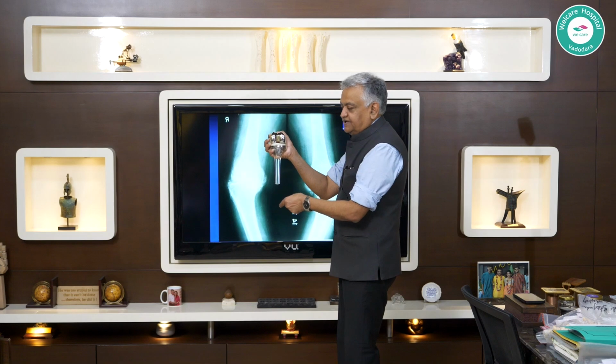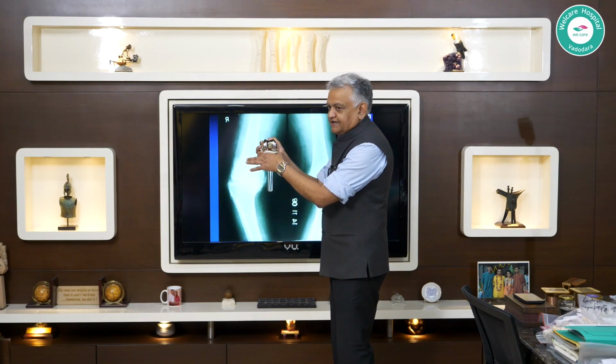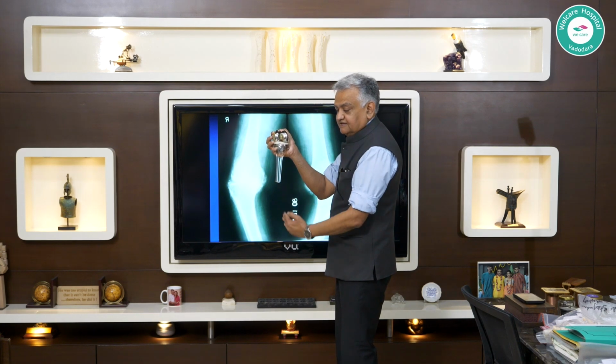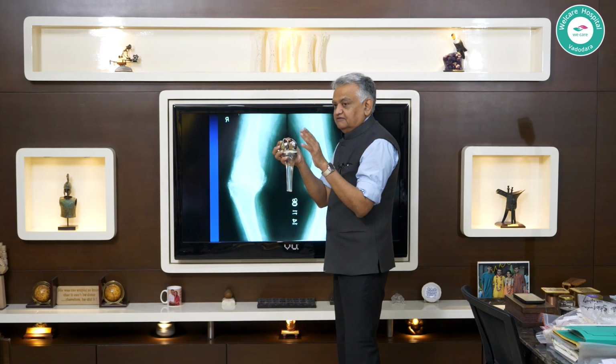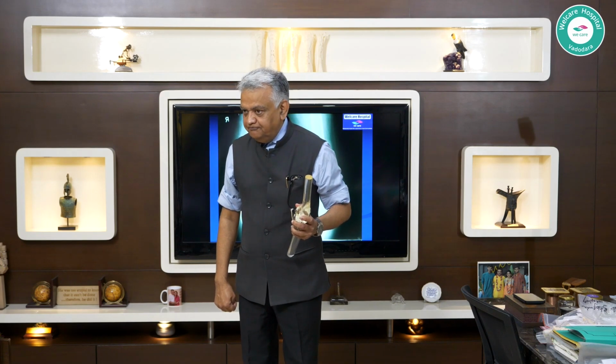So you can ignore this, or in fact you should ignore this, and as long as you get like so from midpoint here and the midpoint down there, if that is in a straight vertical line, then the cut that you are going to make will bring the overall alignment of your limb into that conceptual mechanical axis, which is supposed to be at 180 degrees to the ground force, the horizontality of the ground. Am I able to answer you?